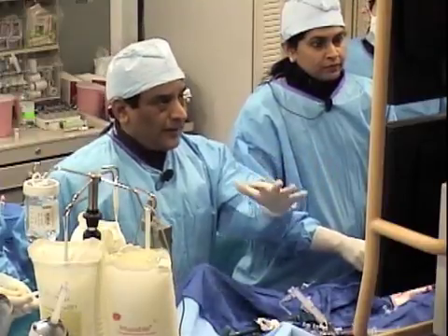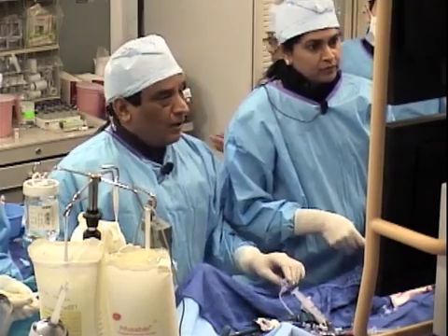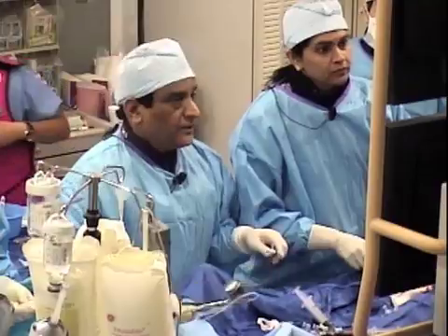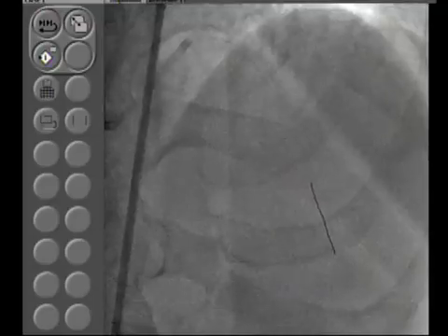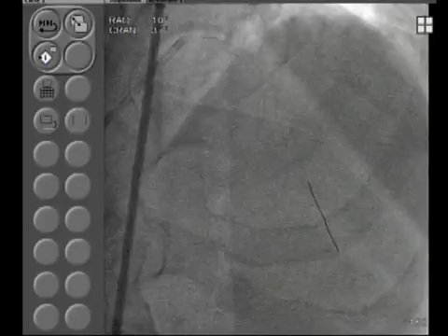But when you're doing ablation it should be about 160, so that with the smaller burr you can go between 180 to 200, which is 200,000, particularly in a burr less than 2 millimeter. Once you are at 2.15, do not go higher than that.